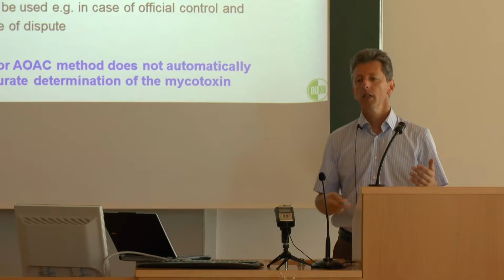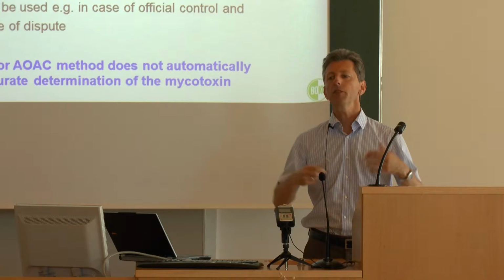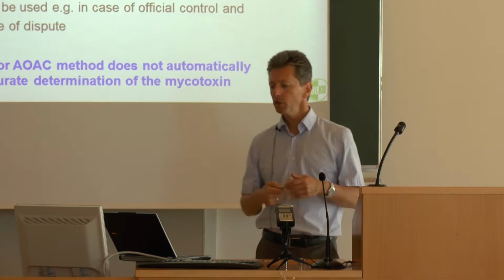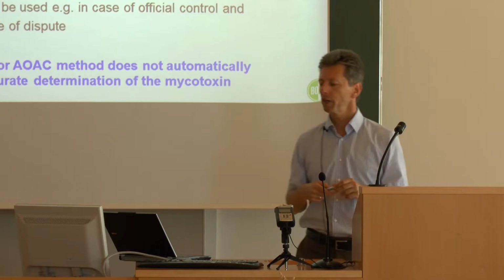And this is certainly based on collaborative studies where the laboratories that participate report their results, and based on the reported results, AOAC and CEN are able to establish so-called expert opinions and to come up with these performance criteria. The performance criteria fulfill what is laid down by the EU regulations for sampling and analysis, in this regulation 2006. So certainly these minimum criteria have to be fulfilled.